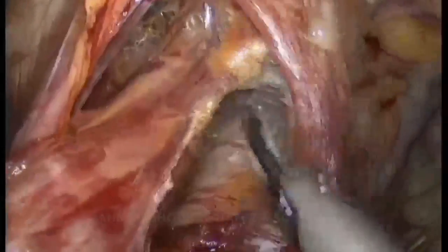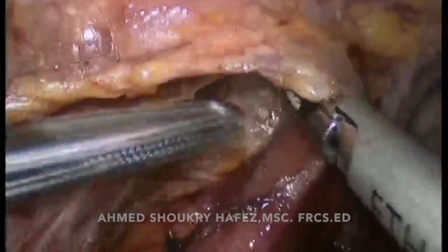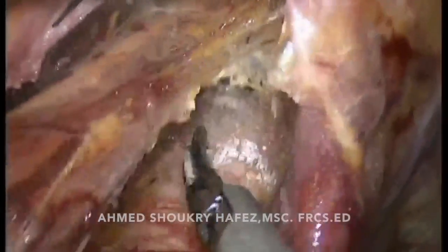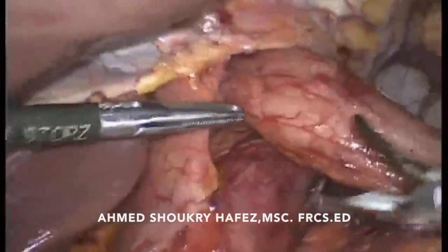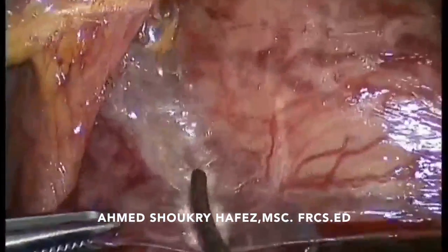A reminder of where the anterior vagus is and that we must preserve it. The descending thoracic aorta is clearly evident posteriorly as we continue our dissection in all directions around the esophagus to gain the intra-abdominal length. And you see now that the esophagus is coming gradually and descends without tension into the abdominal cavity.